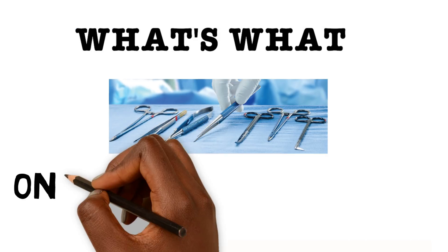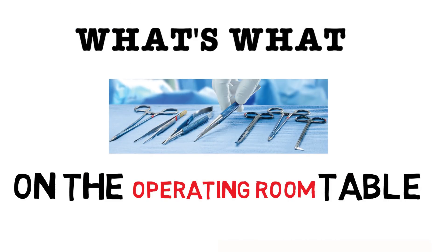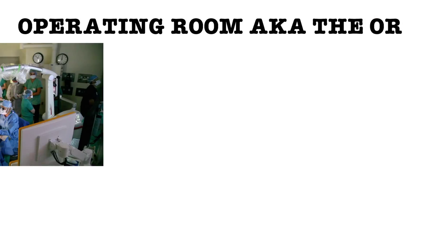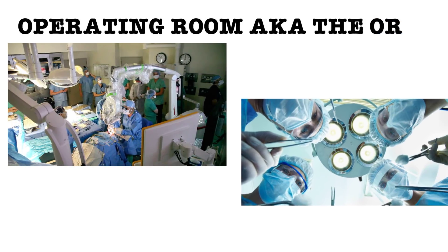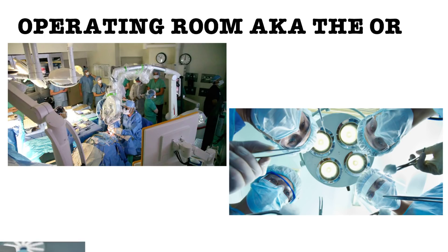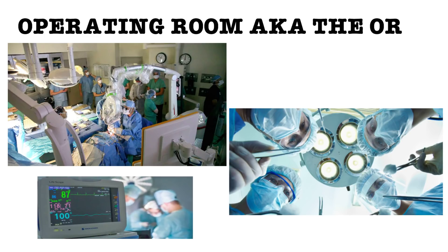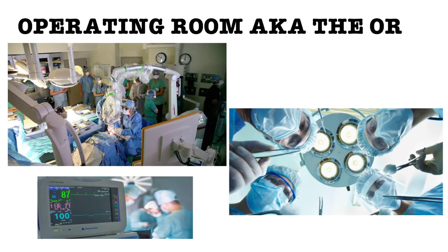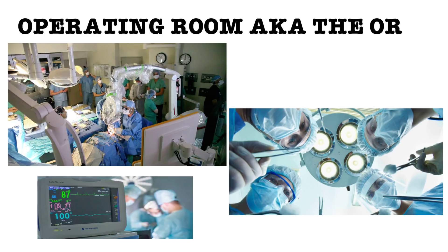What's what on the operating room table? The operating room, aka the OR, can be a very overwhelming place. There are lots of people, noises, machines, tubes, and instruments.